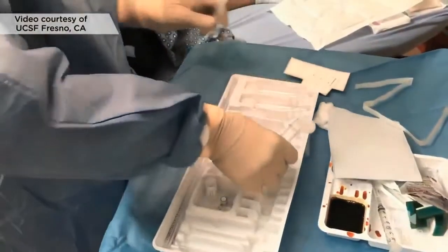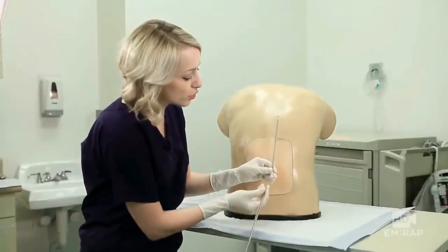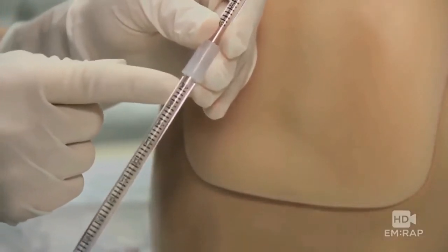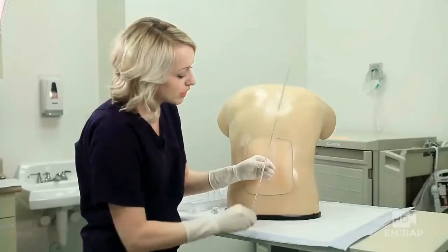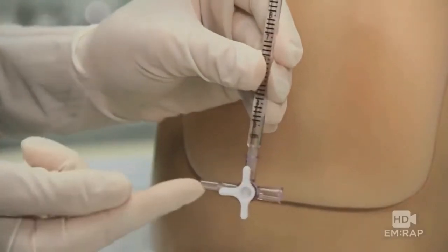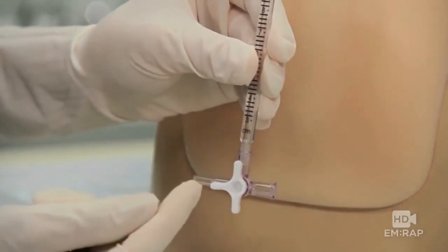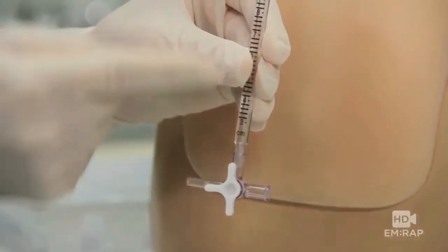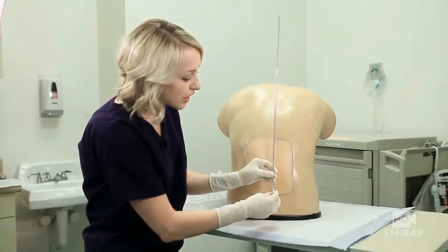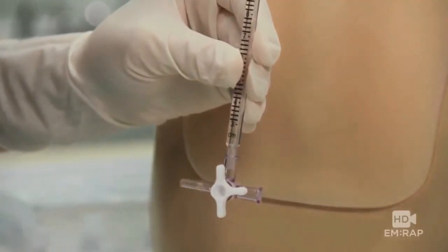Set your tubes up and your manometer if you're going to check an opening pressure. To set up the manometer, take the two pieces of tubing and connect them — that way you can measure pressures greater than 36 centimeters of water. Get the three-way stopcock and connect it. Your spinal needle will connect right there. Make sure the three-way stopcock is open to the spinal needle and to the manometer so the fluid column can rise up. Once you're done measuring your pressure, turn the three-way stopcock so you collect the fluid from the column into your collection tube.